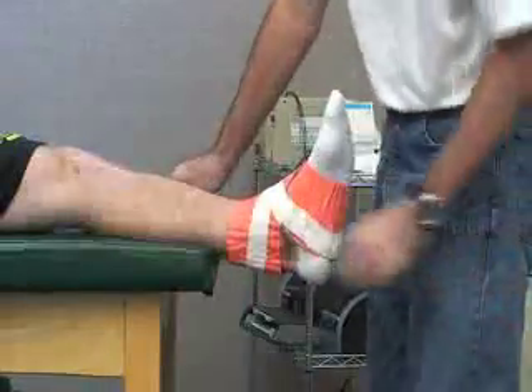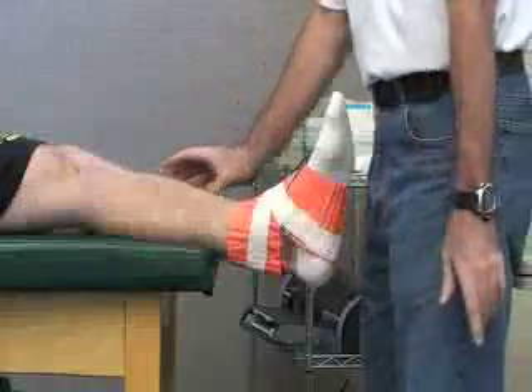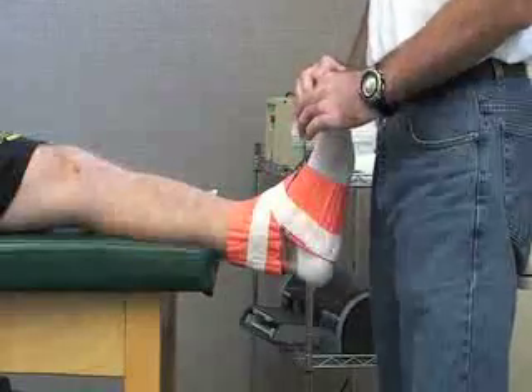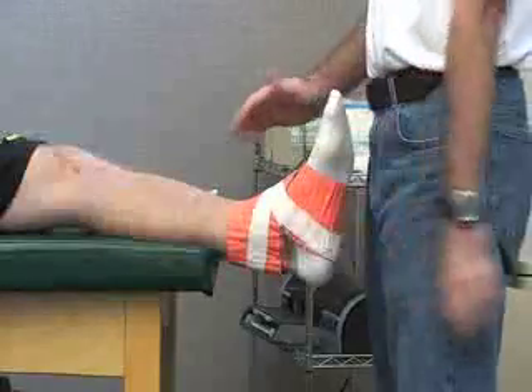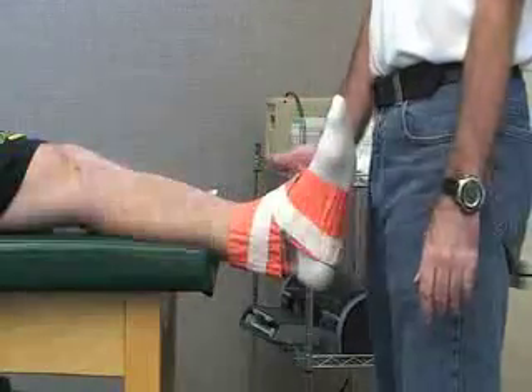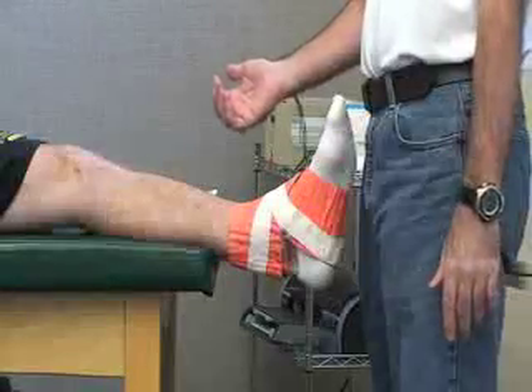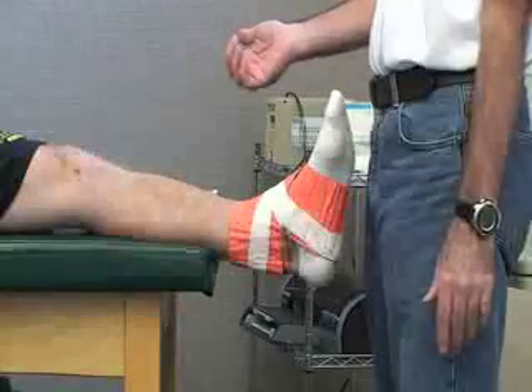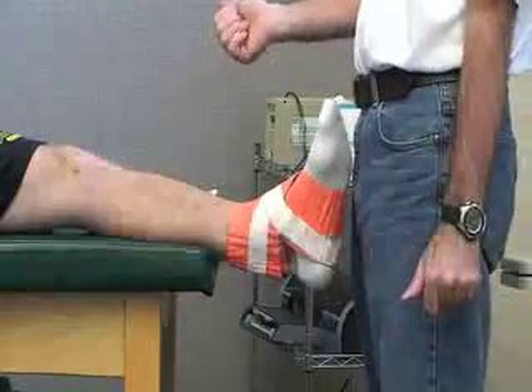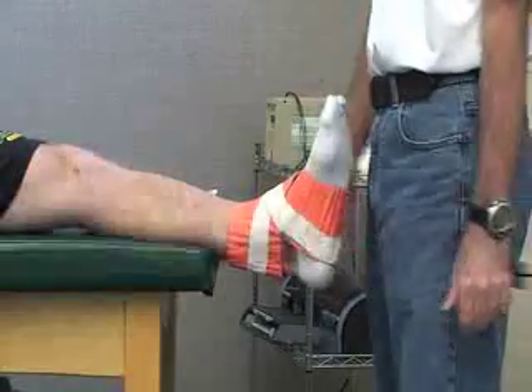Any gaps, you can just pinch it to close the gaps. Next we want to check our distal pulse, capillary refill, and sensation distal to the injury. Once these are immobilized, we also want to make sure that we refer them to doctors for x-rays and further follow-up treatment.